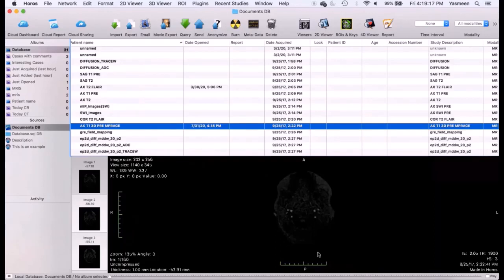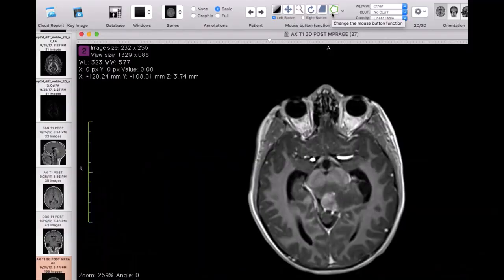Select the album which will display the image sequences shown. Select the desired MRI series and a 2D volume window will open. This image series can be scrolled through and viewed until the tumor is visualized.